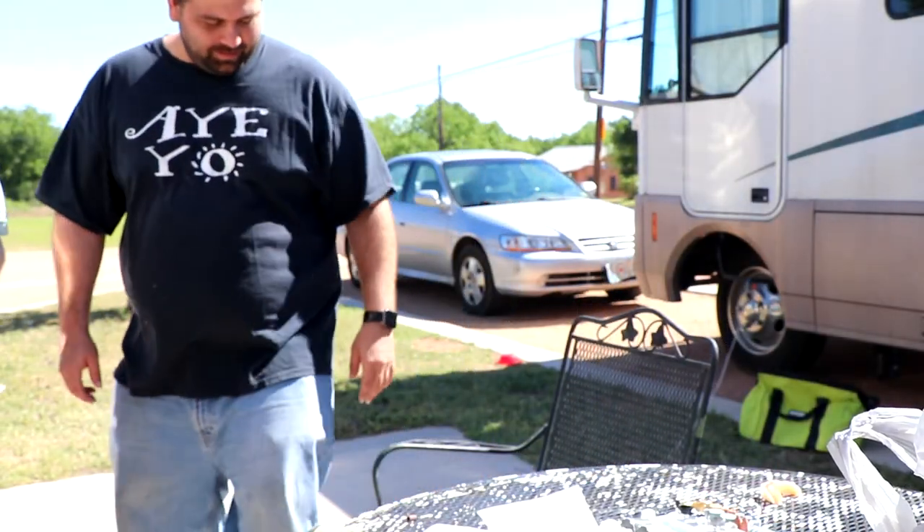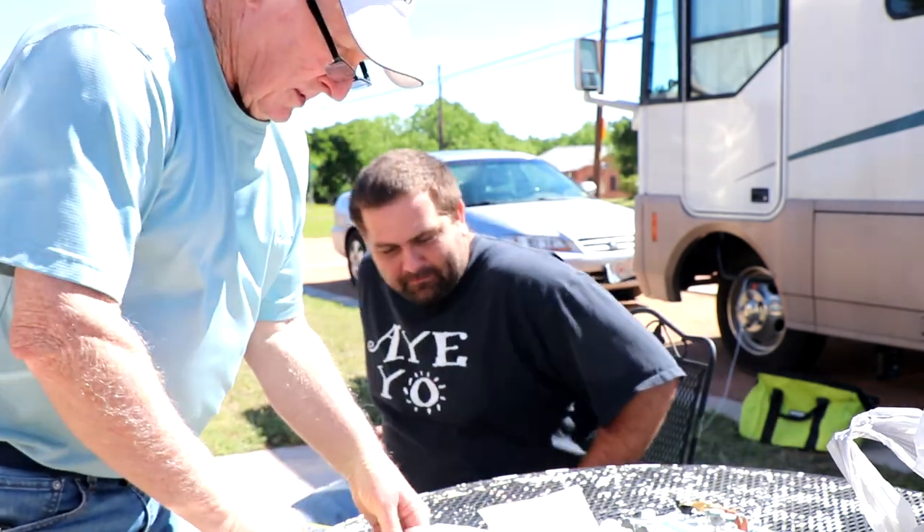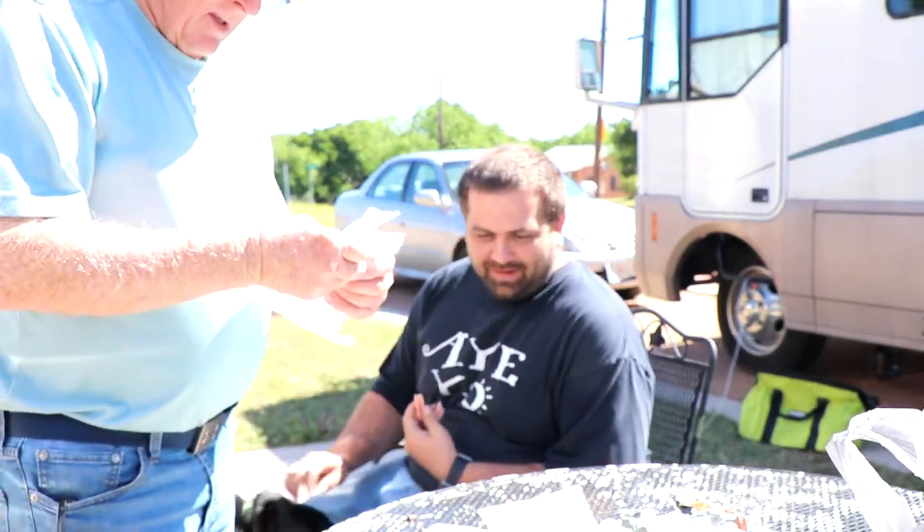So what we're going to do today - we're doing an in-house reline on the floor of the dentures. A lot of people are afraid to go to the dentist, and here we make one up right in the parking lot.